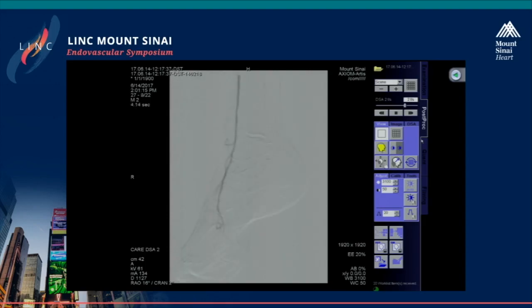Maybe a comment from my side. I don't know if everybody would agree to do that through the plantar loop. Personally, I would not do it, because I would first try everything to do it antegrade. I don't think the clinical situation really gives a strong direction that we need to do it. And going through the plantar, we've seen a number of occlusions, probably due to the friction of the devices and so on. I would also try it from antegrade before.